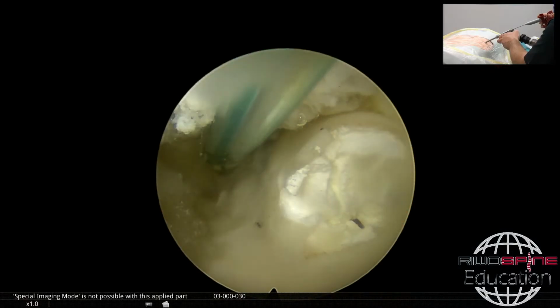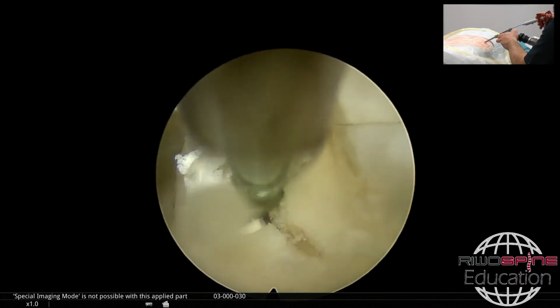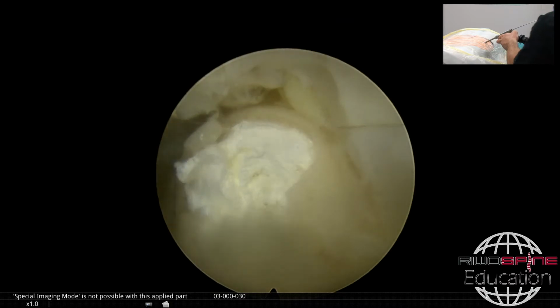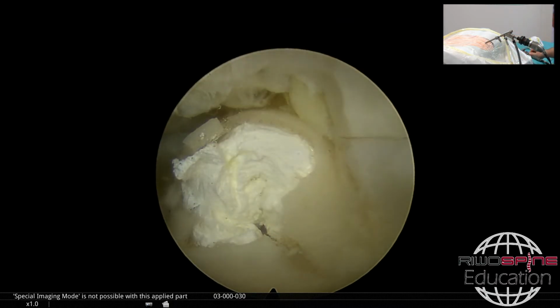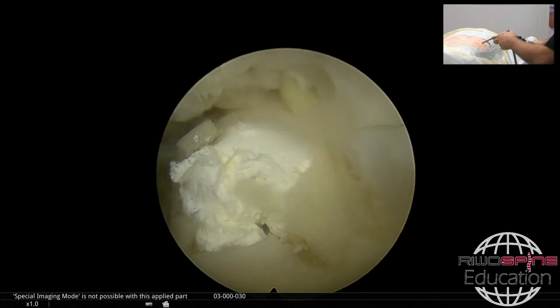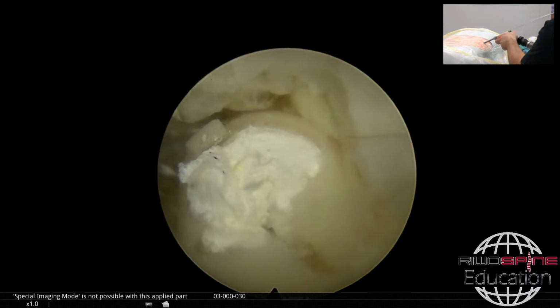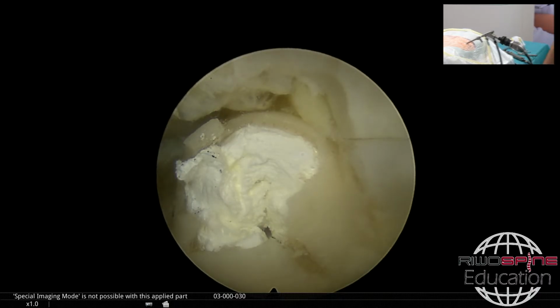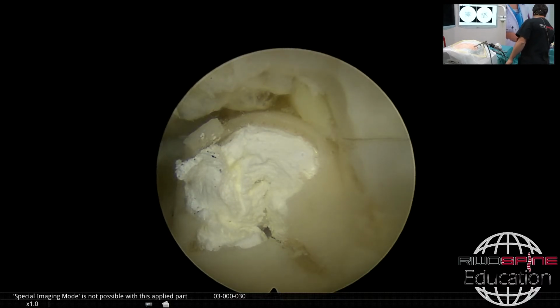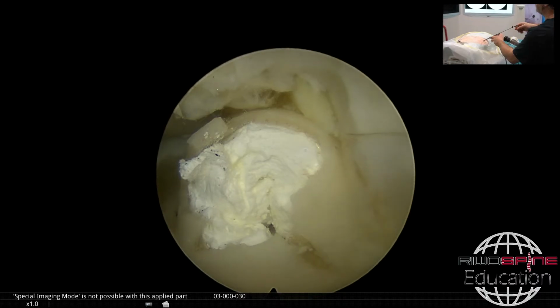Yes. Can you show us? You have just used different kinds of instruments, just to be clear for our viewers. So this is your electrode. That's clear. Basically, for the transforaminal approach, we have the scissors instrument that you can cut with. And this is the 2.5 millimeter rongeur that you can grab something with. And of course, we have different sizes here, for example, this one is the largest one, the 4 millimeter.